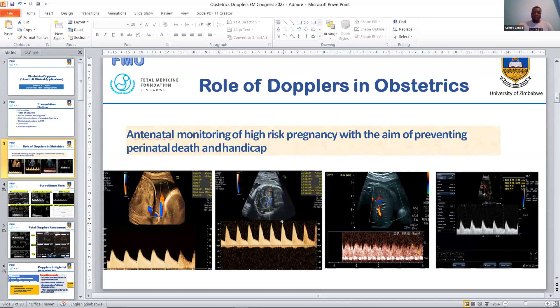The MCA is done on the greater wing of the sphenoid bone with a gate of two millimeters. Then we have the ductus venosus, shown in the third image, which is done as the umbilical vein turns into the portal sinus. It is one of the shunts in fetal circulation and should also be low resistance. Then we have the uterine artery Dopplers, which should also be low resistance. They are done as the uterine arteries from both sides supply the placenta.